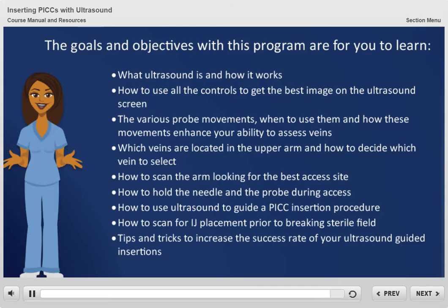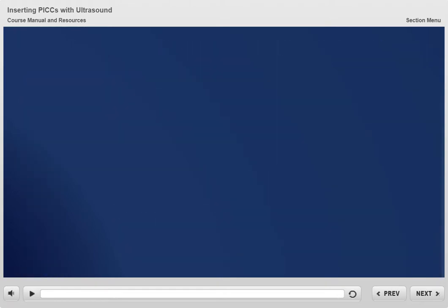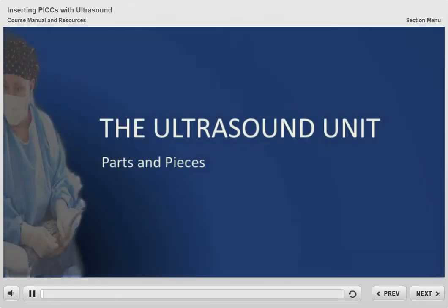Let's get started with the basics of ultrasound guided PICC insertions. Let's begin with the actual ultrasound unit. We need to identify its parts and understand exactly how it works, to best understand how you can use it to benefit your vascular access insertion practice.